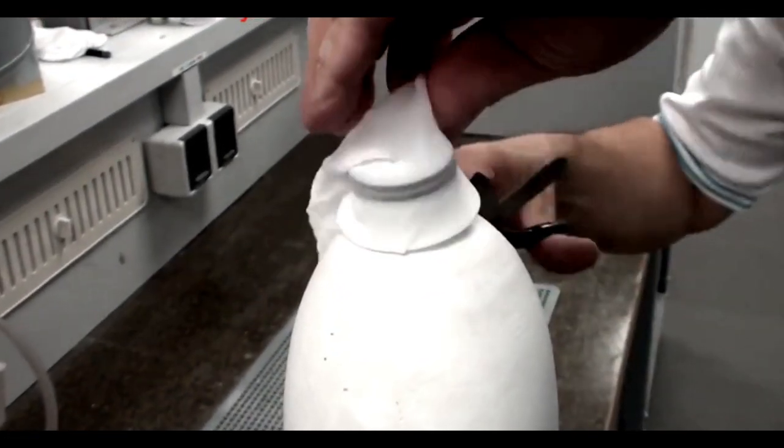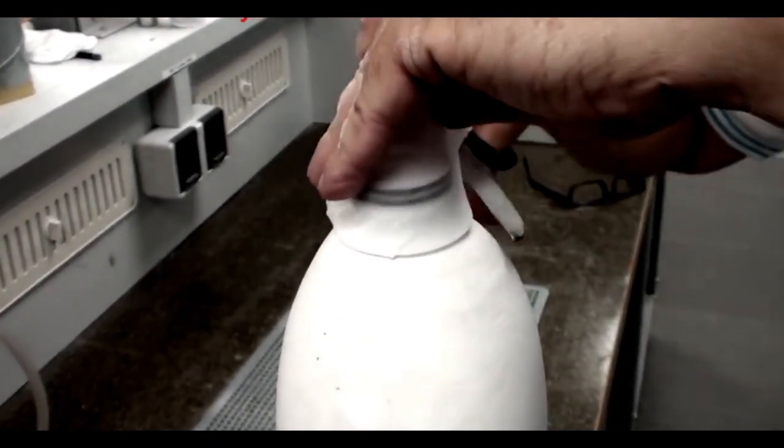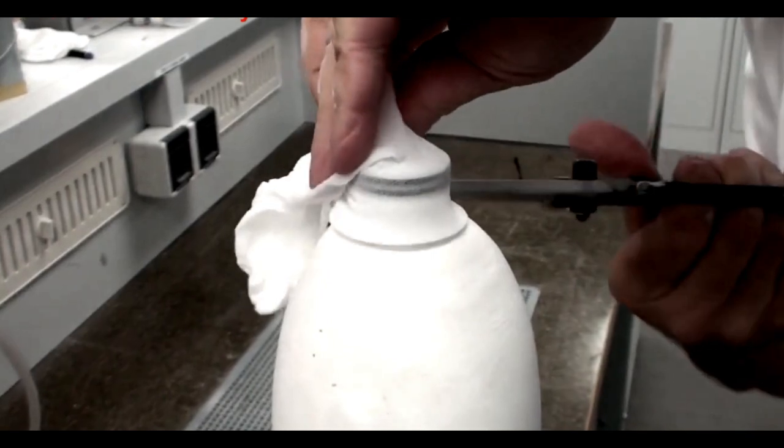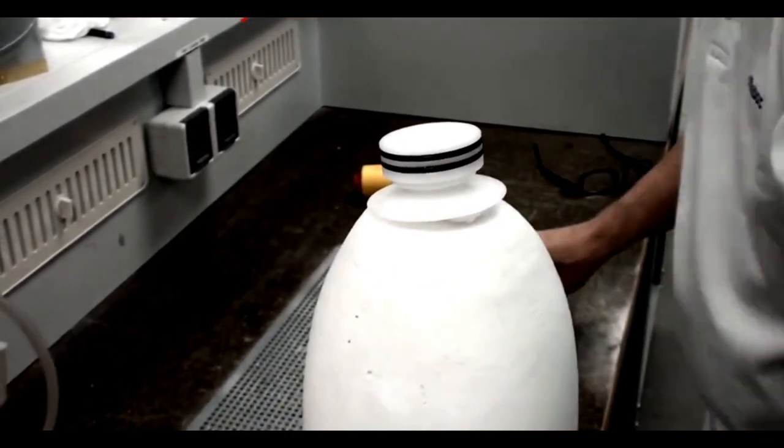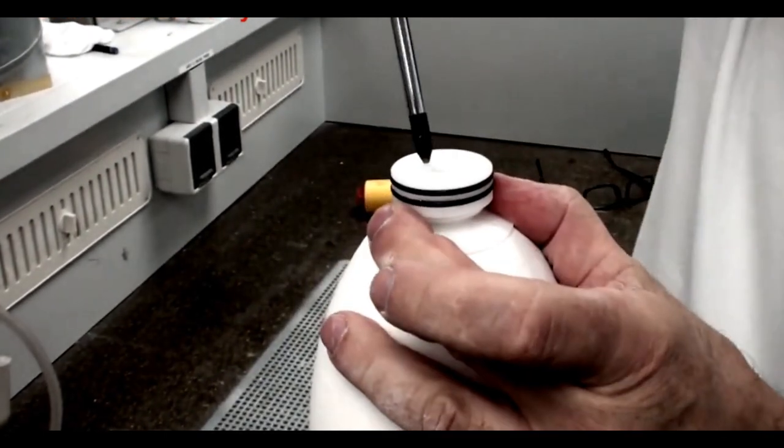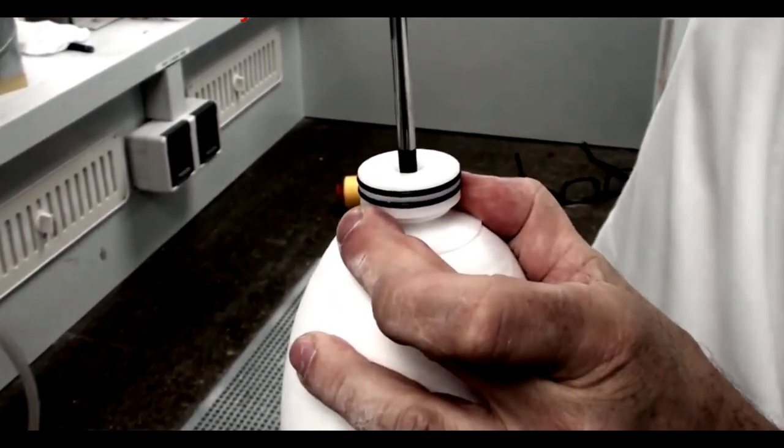Trim off all the excess nylon stockinette to expose the lamination dummy. Finish securing the lamination dummy to the positive model.